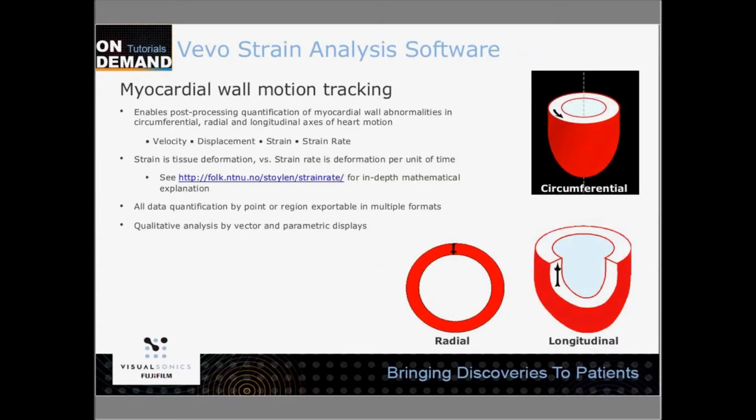So for anybody who's heard of strain analysis but isn't really clear on what it's all about, here is a really quick overview of what strain analysis and what myocardial wall motion tracking is all about.